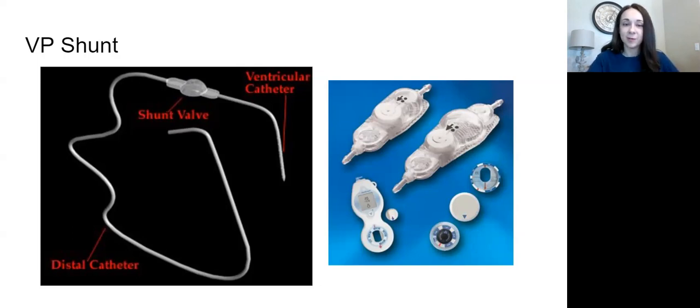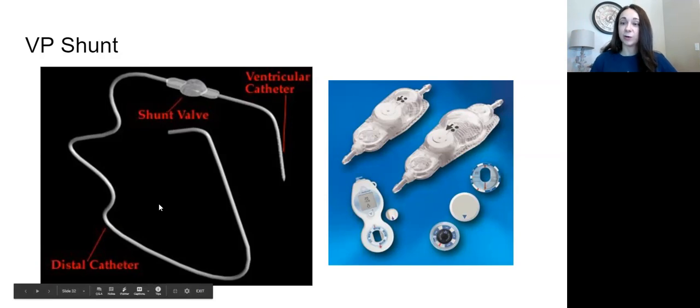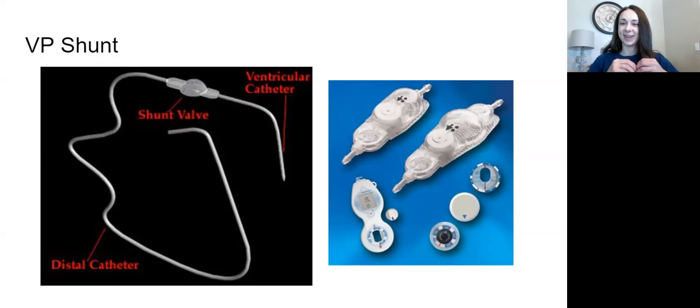So one more time, I want to point out the ventricular catheter is proximal. It's going to be in your head, correct? In the ventricle. This little valve, the shunt valve, will be somewhere behind your ear. And then from there, it gets tunneled, and the distal catheter is what's going to be in your peritoneum. So one, two, three pieces all put together.